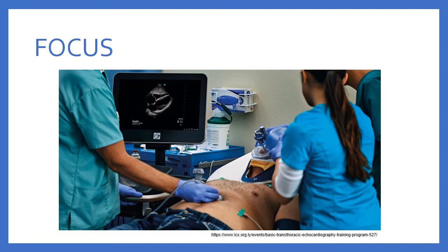Lastly, focused cardiac ultrasound is only trying to answer 1, 2, or 3 questions about the patient as opposed to trying to diagnose a wide range of pathology. And so it's very important that we differentiate these two things because FOCUS will miss a lot of different diagnoses that you may find with formal echocardiography, and it's important that we don't confuse the two.